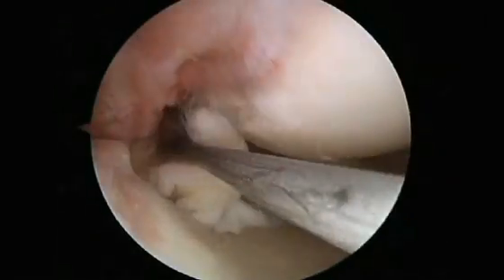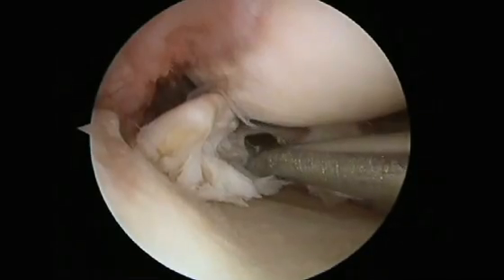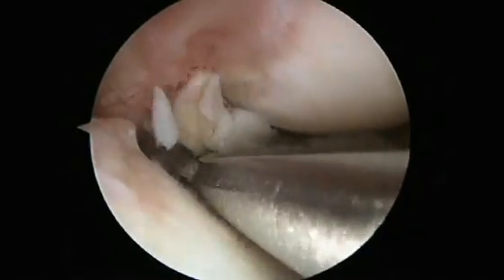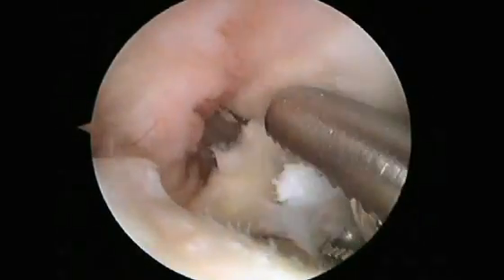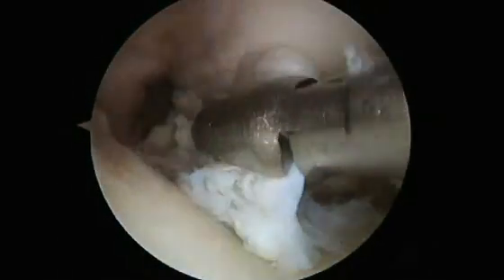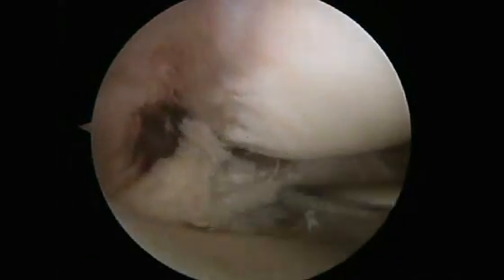One of the instruments you're going to see on the video is a basket or punch that you actually punch out little pieces of the meniscus to remove that part of the meniscus. Also in the video there's a portion of the meniscus that's loose and that's grasped and pulled out. Following that the rim of the meniscus is trimmed in a couple of ways. We do use a power shaver, it's like a roto-rooter that sucks the little pieces of the meniscus into the shaver and then cuts them off.